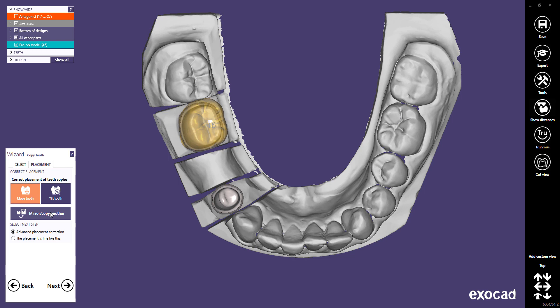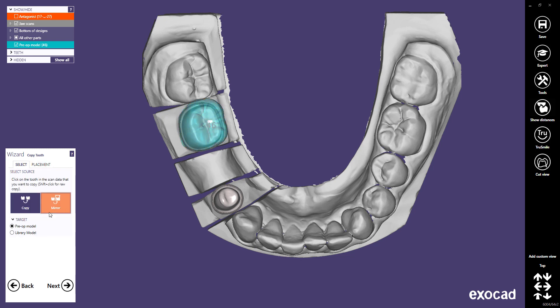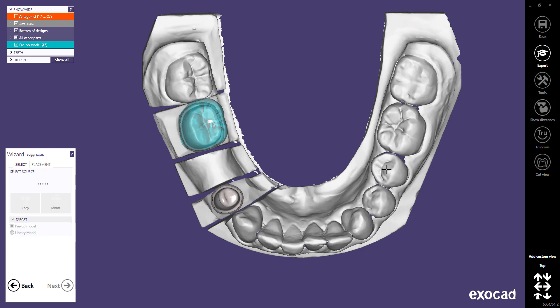If you want to do the same with another tooth, click the Mirror Copy Another button. Perform exactly the same operation with the next tooth — a simple click on the center is enough.